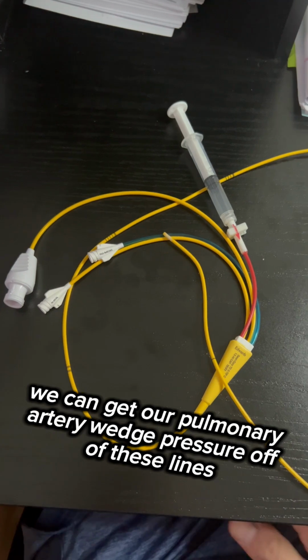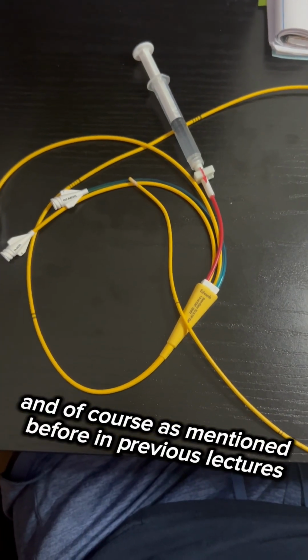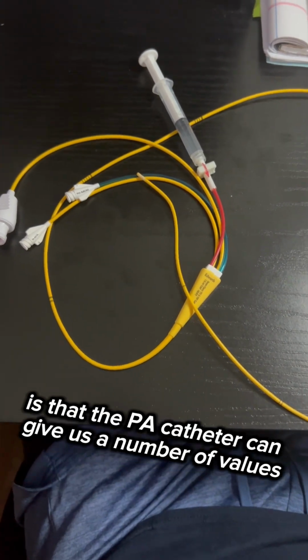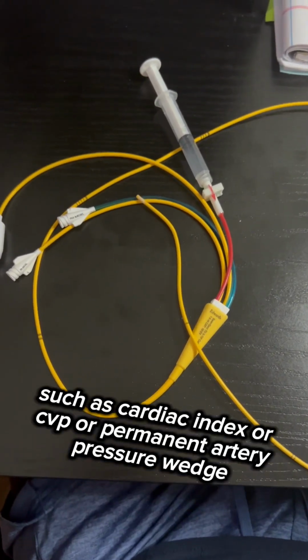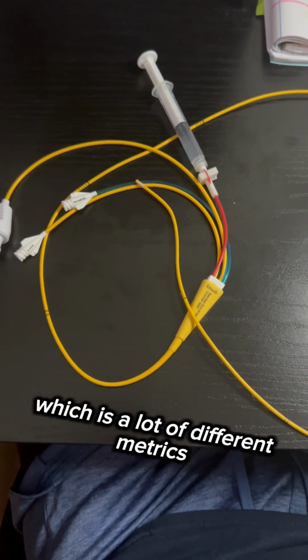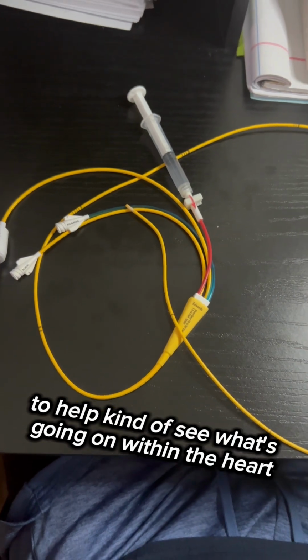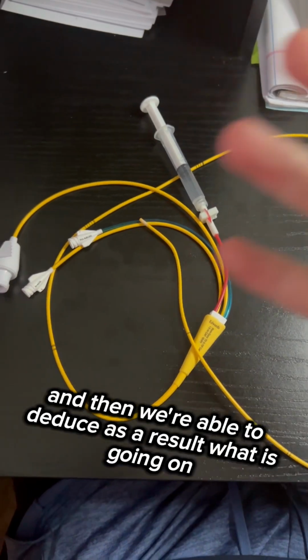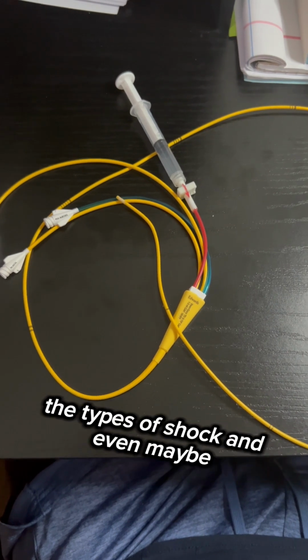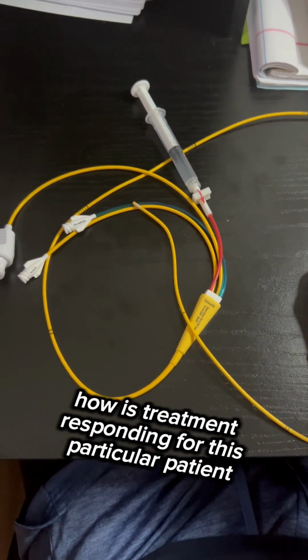But we can obtain our CVP, pulmonary artery pressure, and we can get our pulmonary artery wedge pressure off of these lines. And of course, as mentioned before in previous lectures, the PA catheter can give us a number of values such as cardiac index, CVP, pulmonary artery pressure, wedge, which is a lot of different metrics to help see what's going on within the heart. And then we're able to deduce as a result what is going on, the types of shock, and even maybe how treatment is responding for this particular patient.